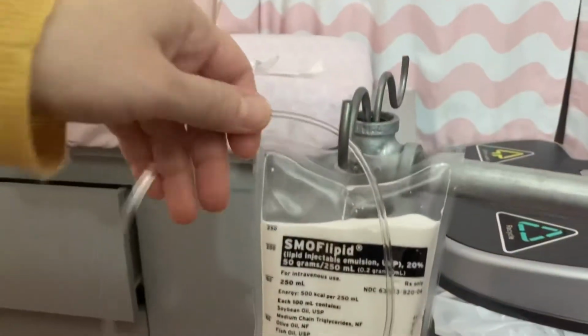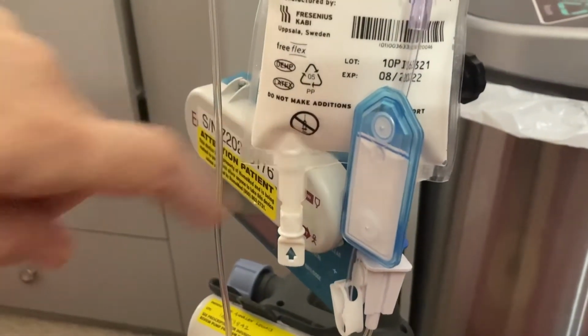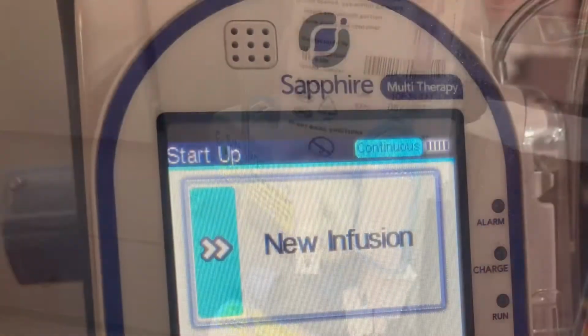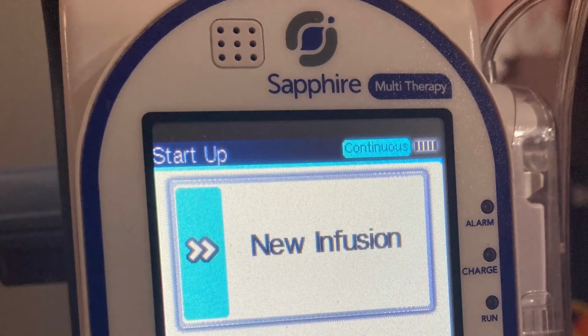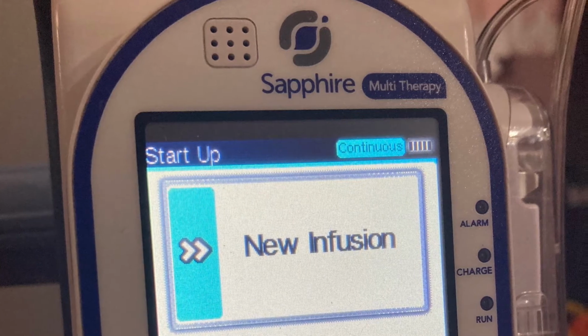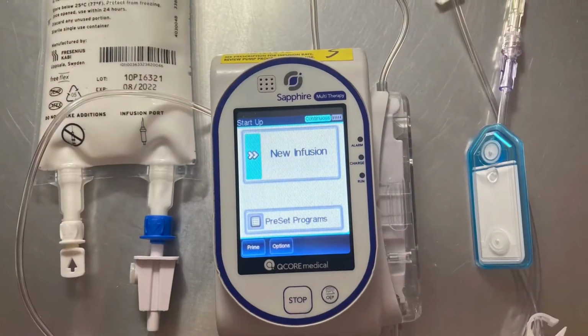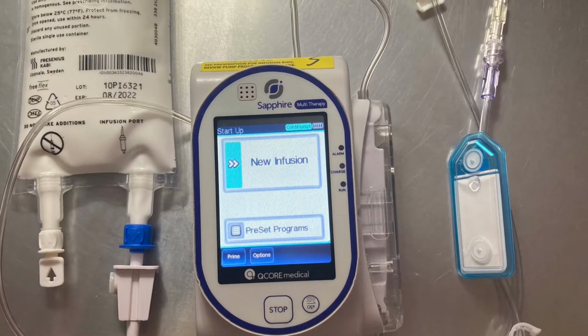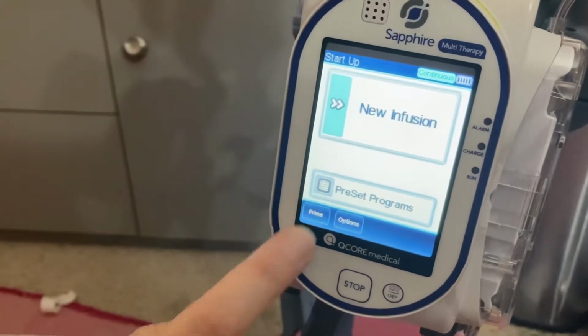You want to make sure the filter is right side up when you prime through the line. Hanging it on the pole like this ensures it will be. You will see the blue label at the top right corner of this pump that says continuous. That ensures you have the right pump for the lipids. What is nice about this is that the cap on the lipids bag, the label on the pump, and the filter are all blue. Press prime and prime again.